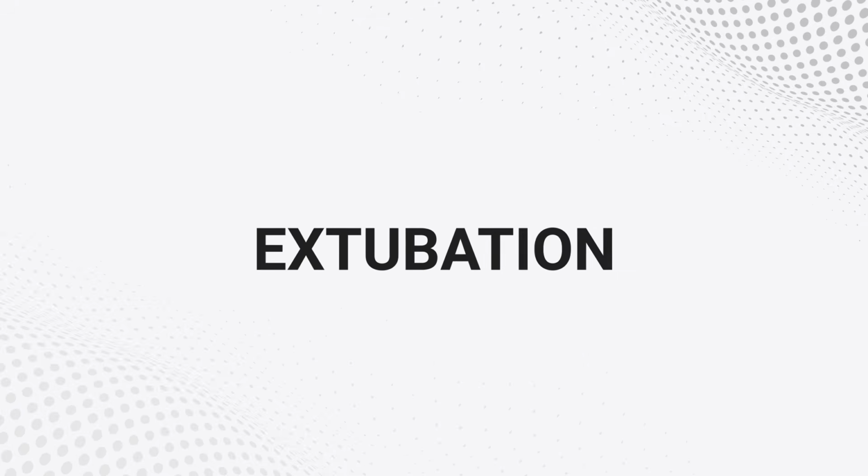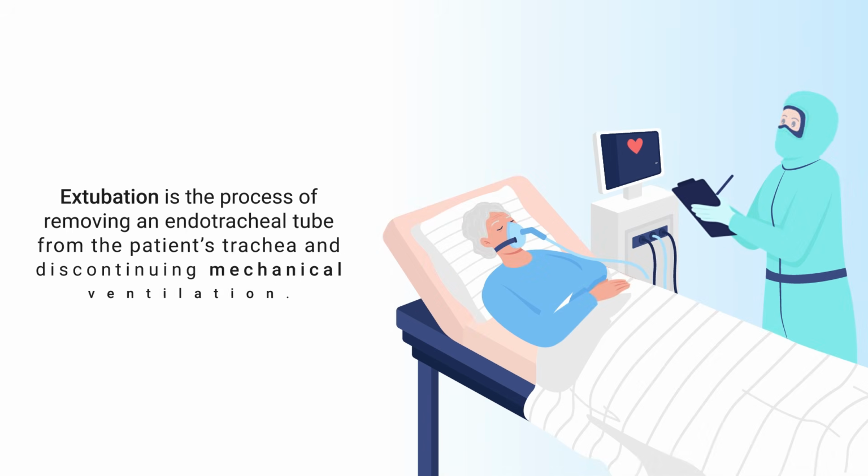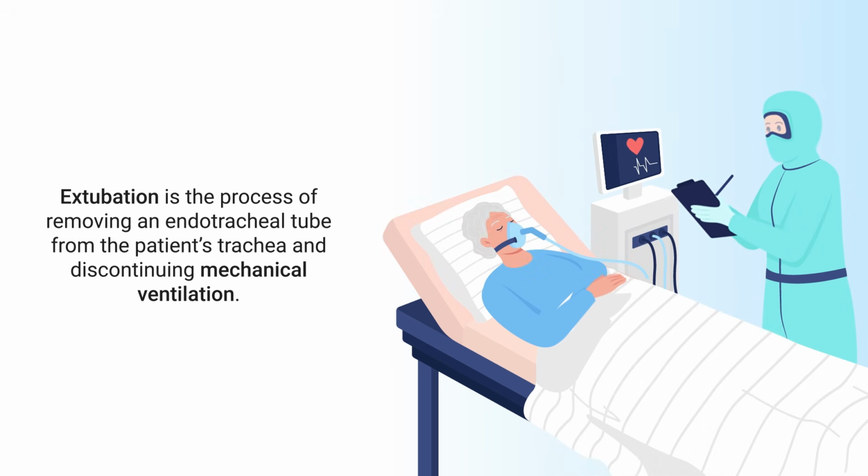And that leads to the next topic, which is extubation. Extubation is the process of removing an endotracheal tube from the patient's trachea and discontinuing mechanical ventilation.